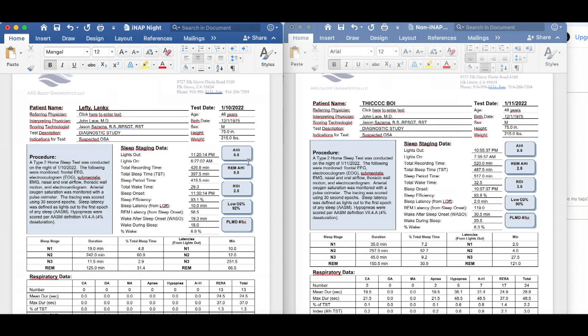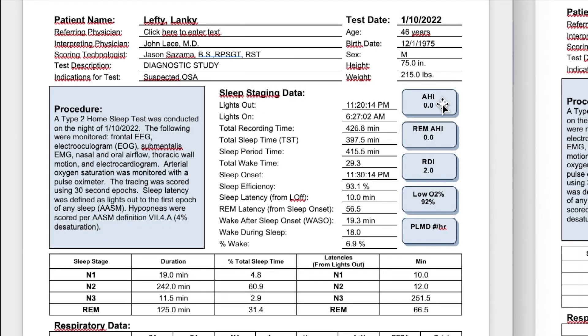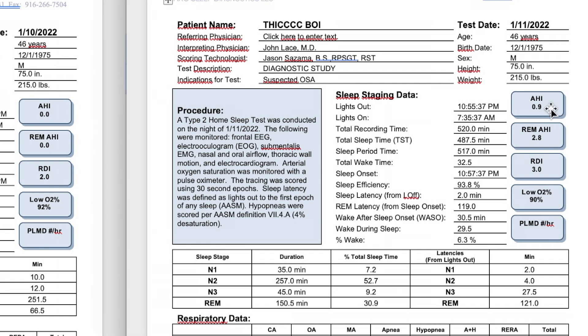On the iNap night, while using intermittent negative air pressure, I have an AHI of zero, a REM AHI of zero, and an RDI of 2.0. AHI — apnea hypopnea index — is the number of apneas and hypopneas per hour of sleep. REM AHI is the same thing but for REM-only sleep. RDI pretty much includes everything. Low blood oxygen level is 92 on the iNap side. Moving over to the non-iNap night, we have an AHI of 0.9, a REM AHI of 2.8 — so already I'm worse — an RDI of 3.0, and a low blood oxygen level of 90%. So I'm technically worse on the baseline night.